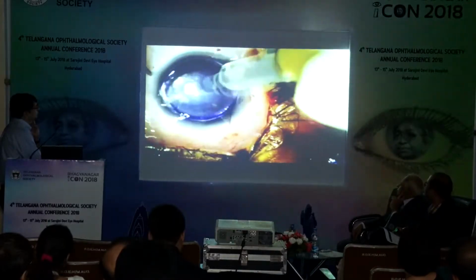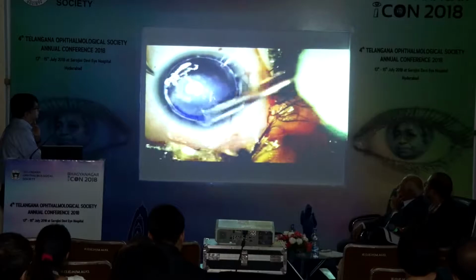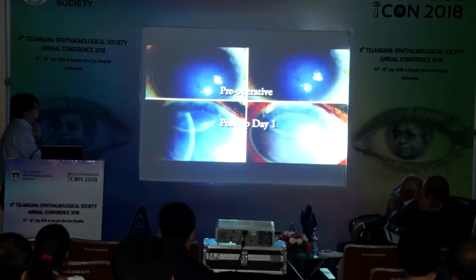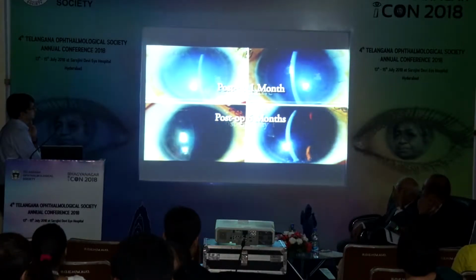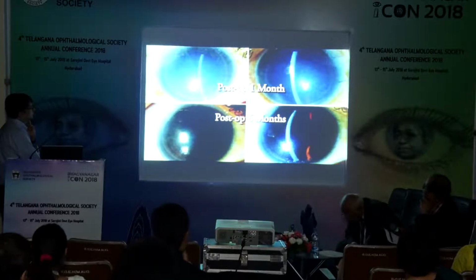At the end of 60 seconds, the corneal surface was thoroughly washed off with saline and a bandage contact lens was applied when required. Serial examinations were performed at day 1 and at 1 week after surgery to assess the intraocular pressure, graft adherence, and epithelial healing. Subsequent follow-up examinations were scheduled at 1, 3, 6, and 12 months after surgery.